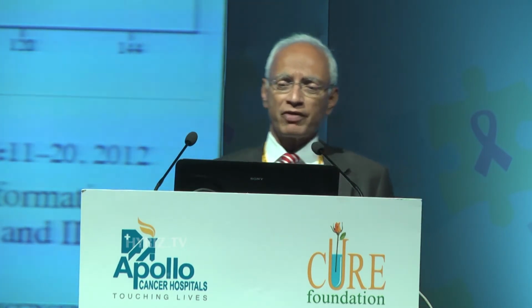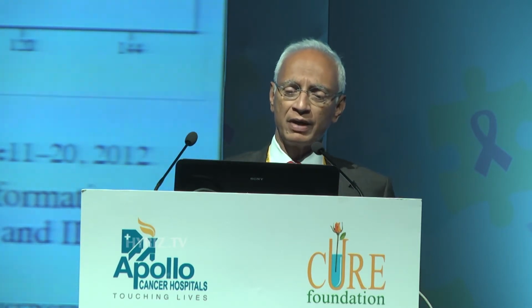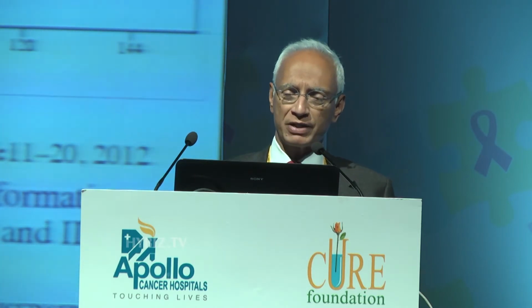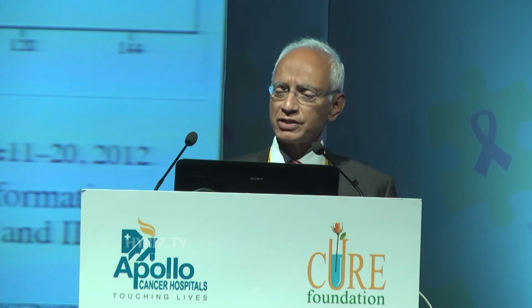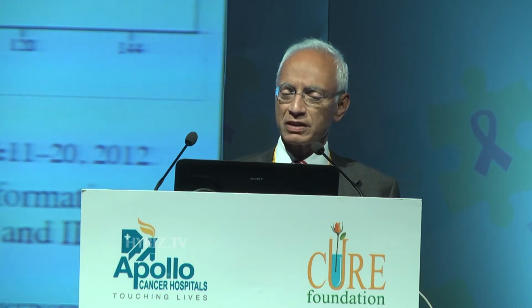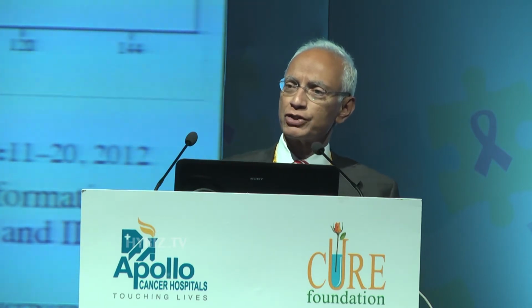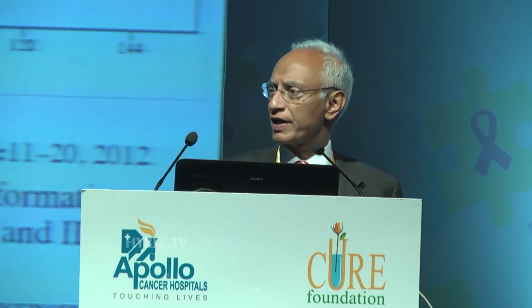And for the nidus obliteration, what are the factors? Volume and dose are important. Patients that have a small volume, less than 2 centimeters, have a much higher chance of obliteration of the nidus. Also the dose: a single fraction of 20 gray. Obviously, for bigger lesions, you may end up cutting back the dose because you don't want to cause necrosis, and there is a lower chance of complete obliteration of the nidus.